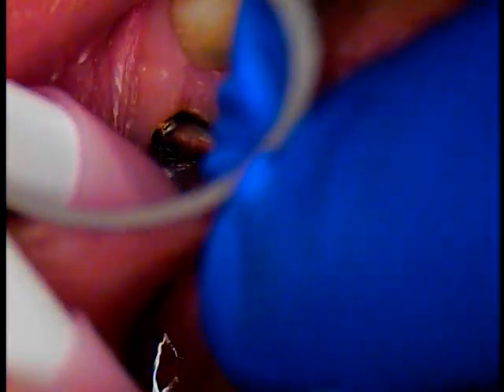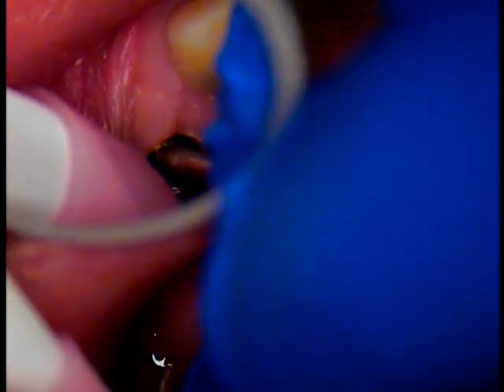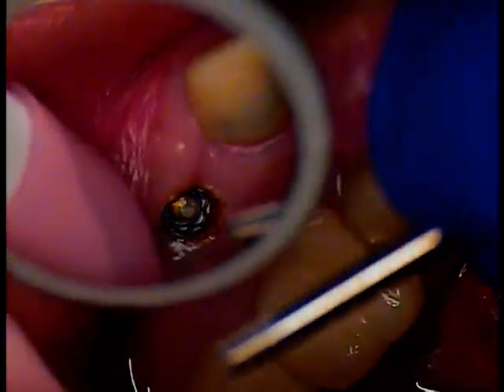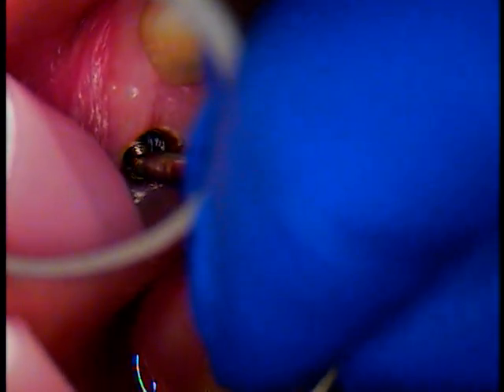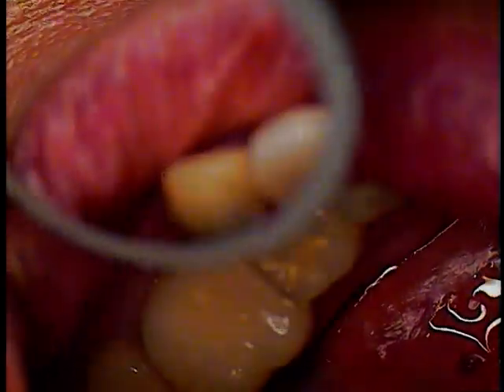Right underneath it. That's a pretty long screw. There it is — you got it, it's in your screen. I want to take a good look at that. But you've got a pristine implant. Everybody's going to be happy.